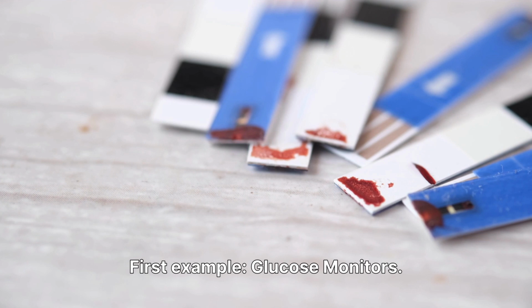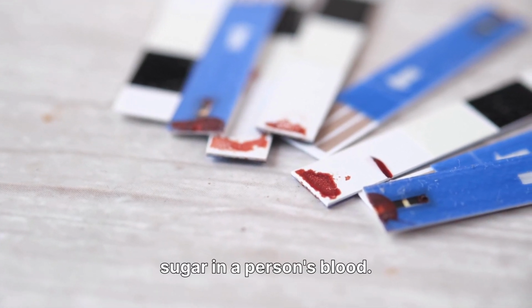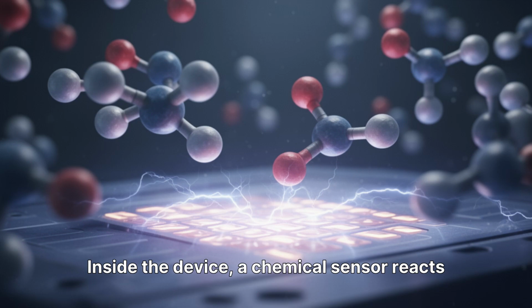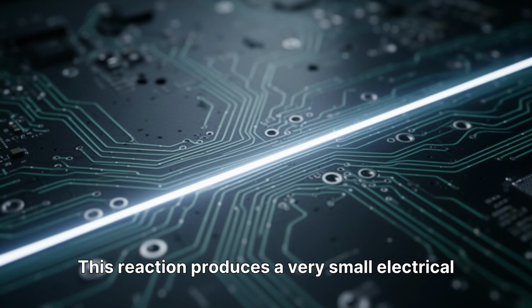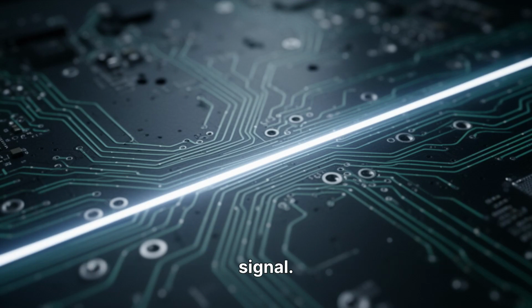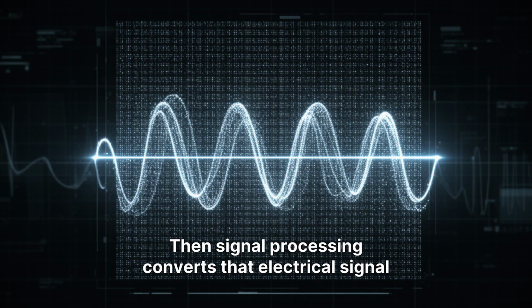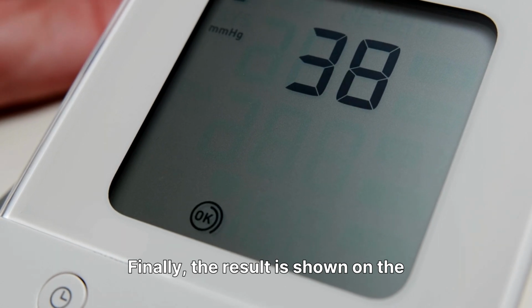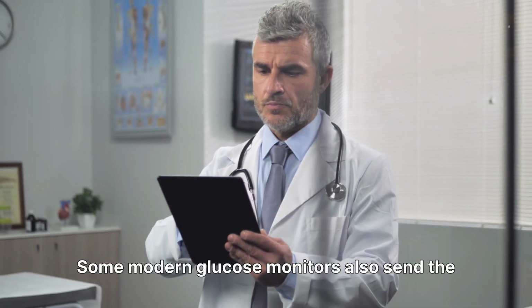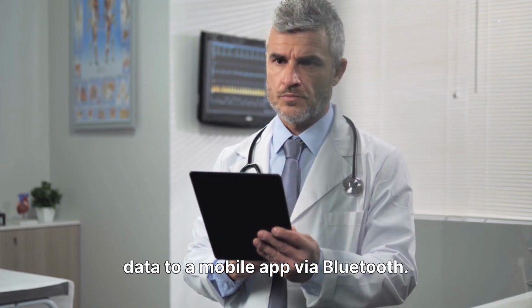First example, glucose monitors. A glucose monitor measures the amount of sugar in a person's blood. Inside the device, a chemical sensor reacts with the blood sample. This reaction produces a very small electrical signal. The microcontroller reads this signal through an ADC. Then signal processing converts that electrical signal into a blood glucose value. Finally, the result is shown on the display. Some modern glucose monitors also send the data to a mobile app via Bluetooth.